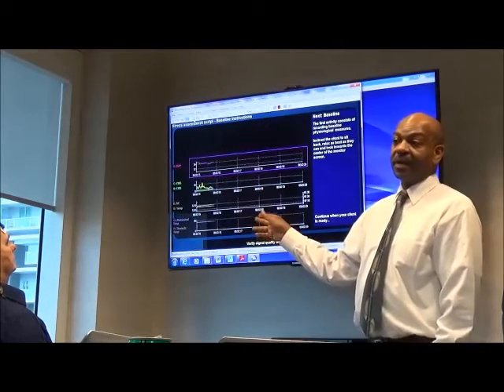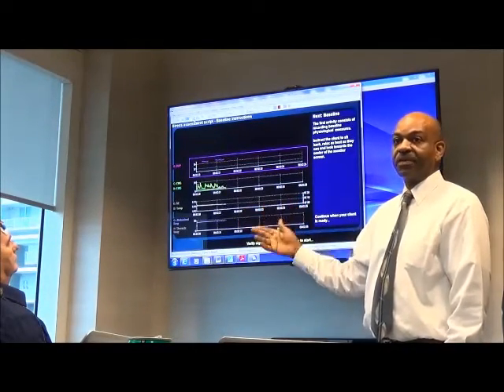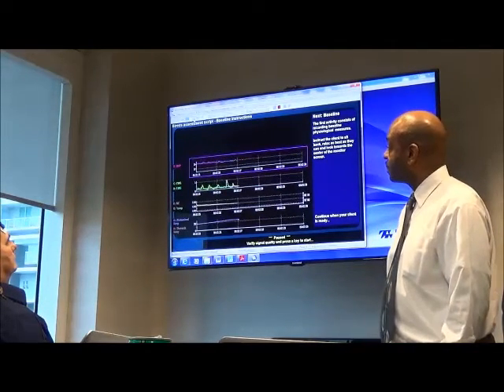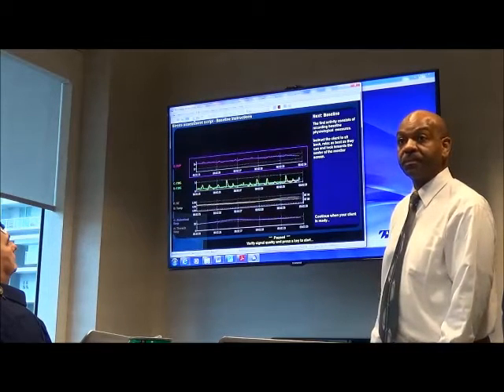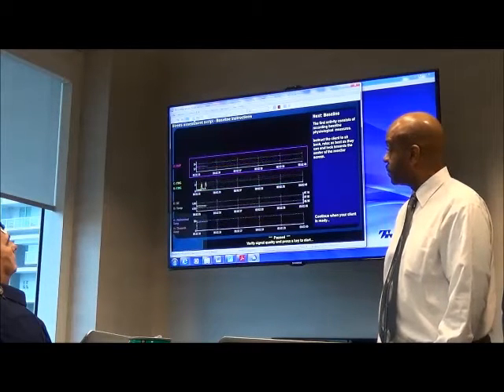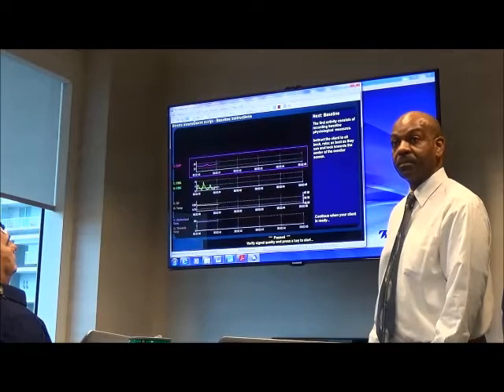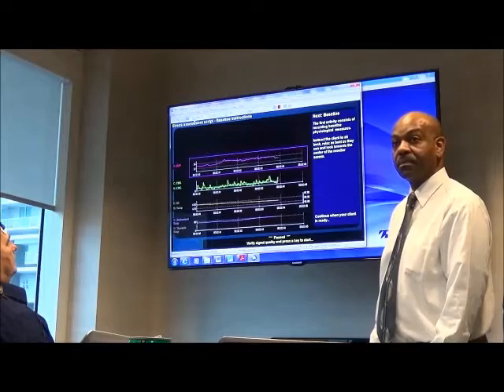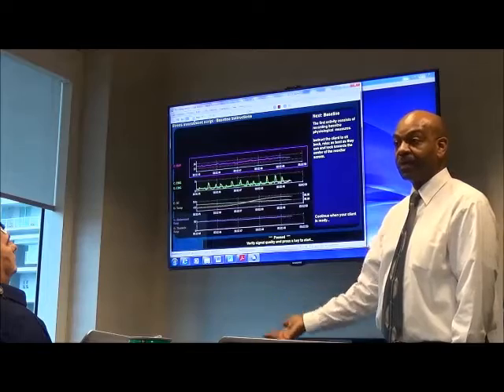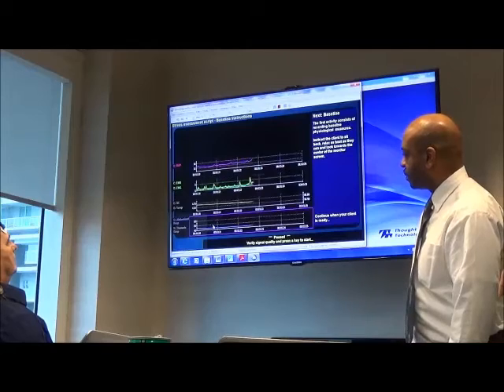Now, while I'm doing this, I wouldn't have him looking at the screen. I would be looking at the screen myself and just ask him to do those things. And right now we saw an artifact due to the movement in the BVP sensor. Can you do it again? Please move your hand, your left hand. Okay, there's an artifact. This is not the real measure. This is a consequence of the movement of the hand. So that's another reason to instruct them to keep their hand still. Now you can probably see it a little bit better. Take a breath.